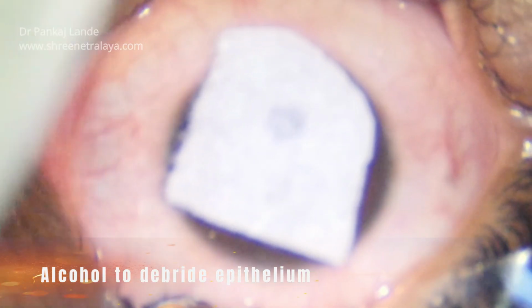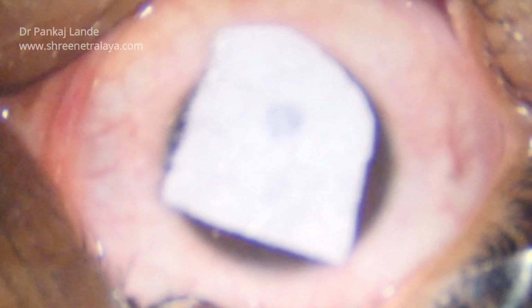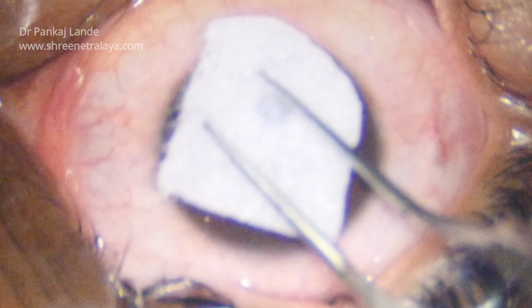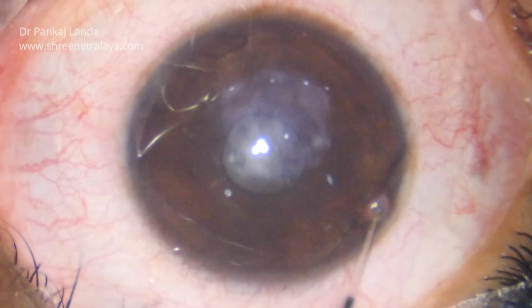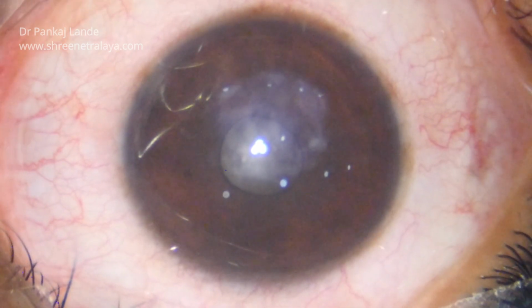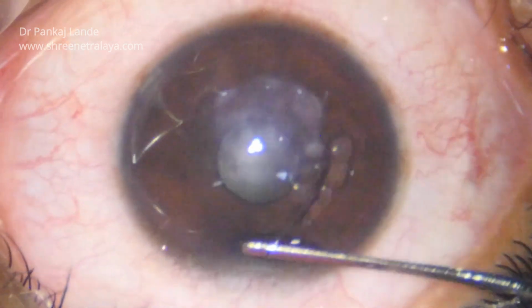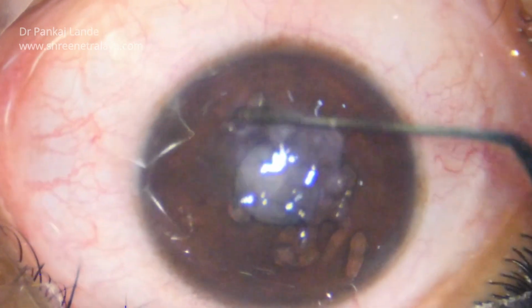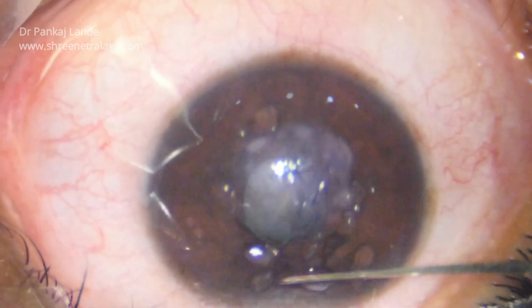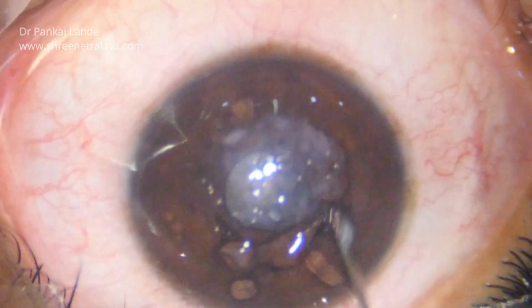To peel off the epithelium easily, we are applying an alcohol swab to the epithelium, which loosens this epithelium to make it easy to peel off. Once the epithelium is loose, it can be taken off with the help of a blunt instrument like an iris repositor or epithelial debrider. Once the epithelium is off, the surface is dried to follow the dissection of a scar.